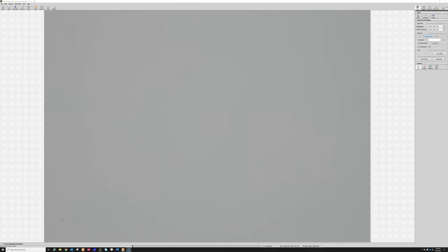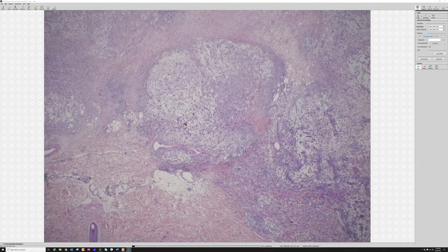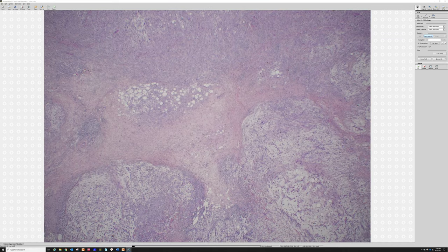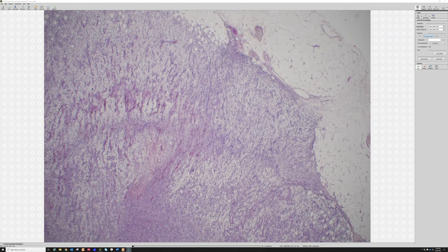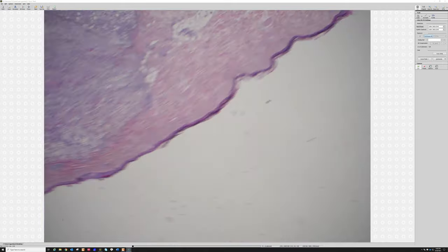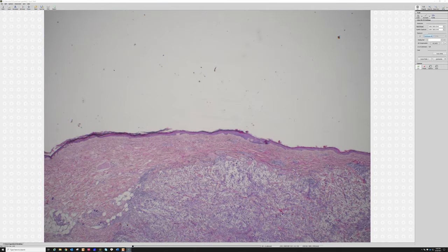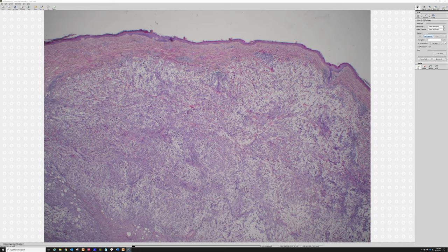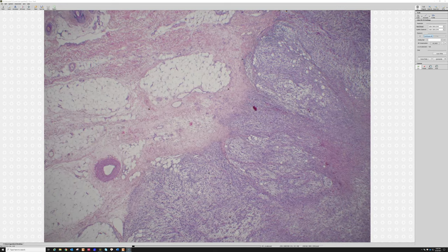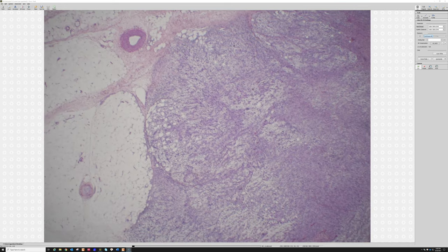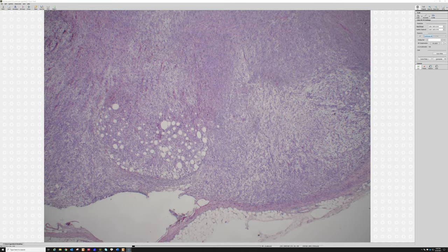All right, finally case number 10. It's a 70-year-old male with a leg mass. Let's see — here's skin, I'll turn it around. We've got a tumor that's going all the way up into the dermis and also infiltrating way down at the subcutis.